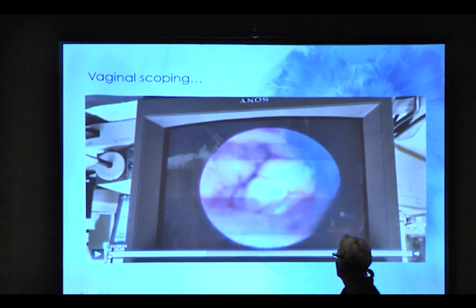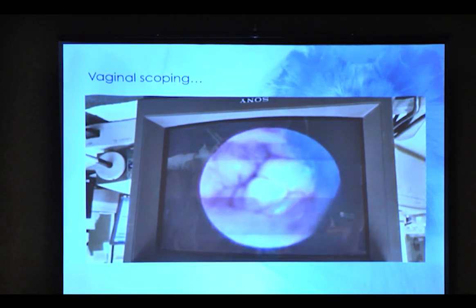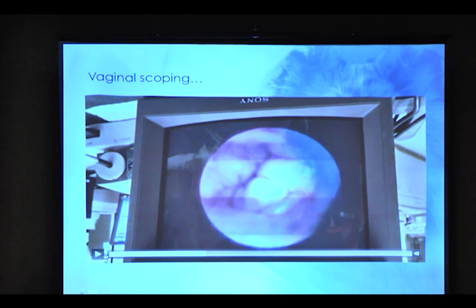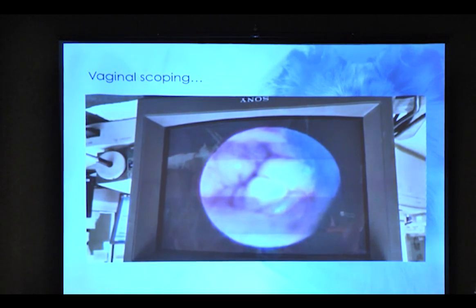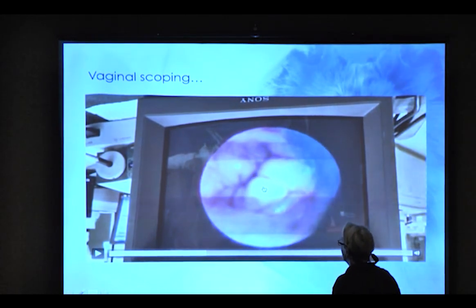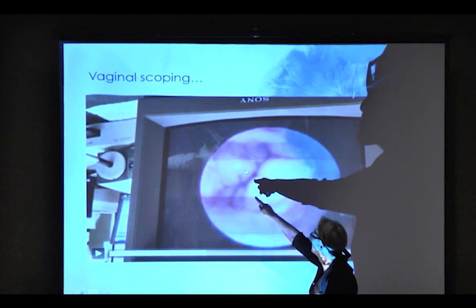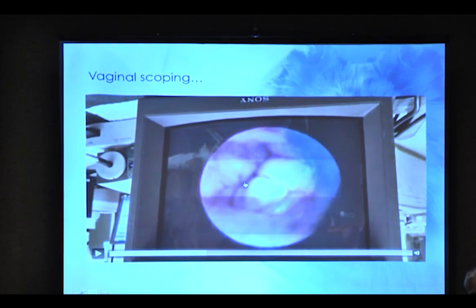Stop. Okay. See that ugly thing in the middle? That is a cervix. That is exactly what the cervix looks like when you want to breed. Isn't that cool? You really have to get into these things. Put the arrow on the ugly thing. The hole is the cervix. See how ugly that is? Bingo. You are now in the cervix.